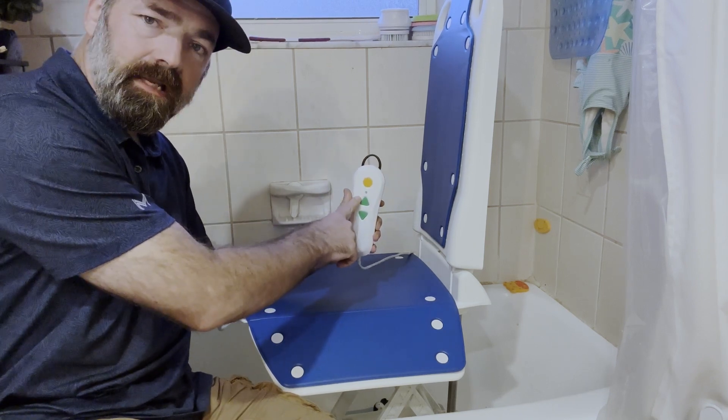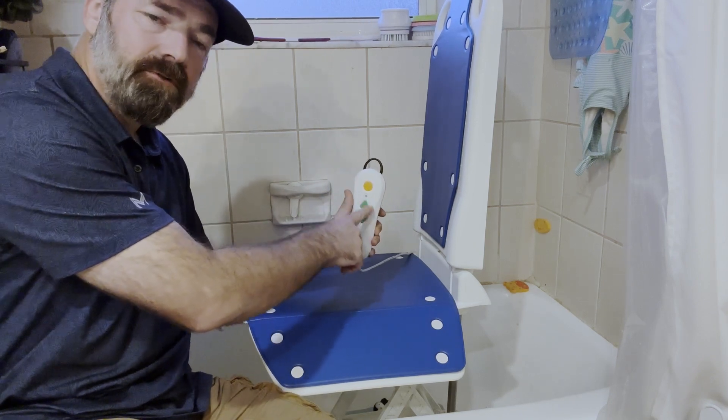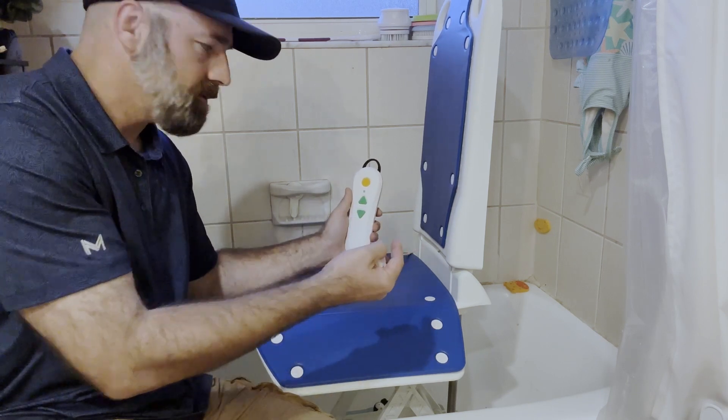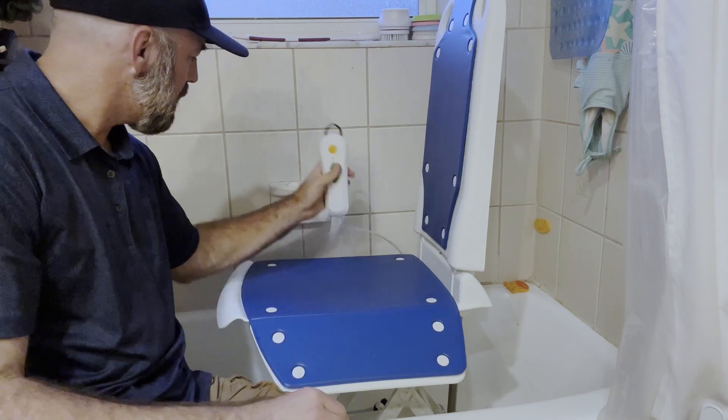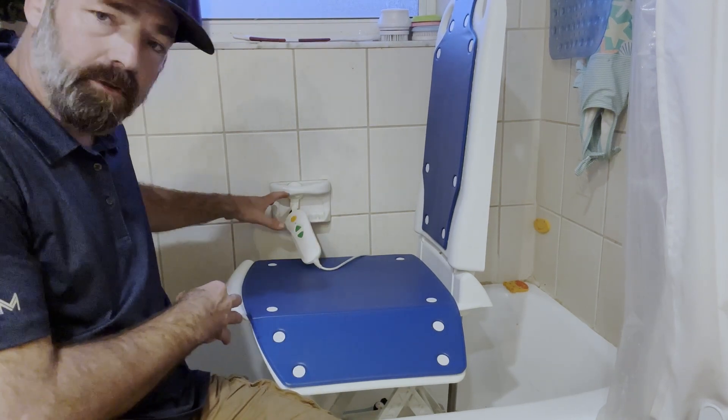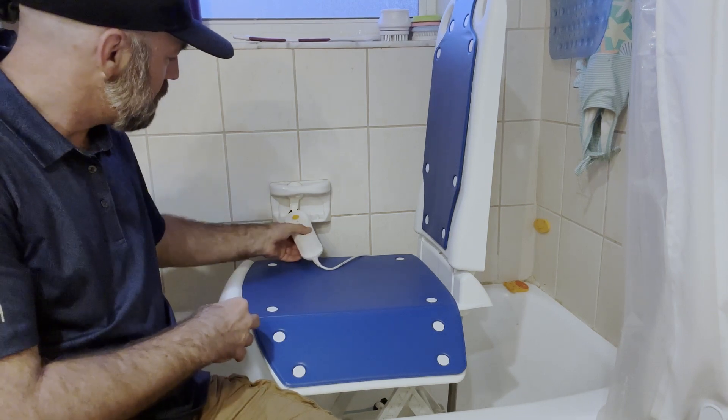You plug your charger in here, and when the light turns green, it's charged. While you're using it, if the light turns red, that lets you know it needs to be recharged. You have your buttons for up and down, and it even comes with a bath mat and a shower hook so you have a place to hang your controller.